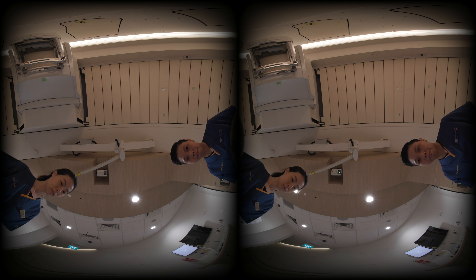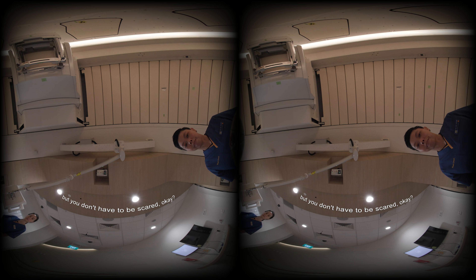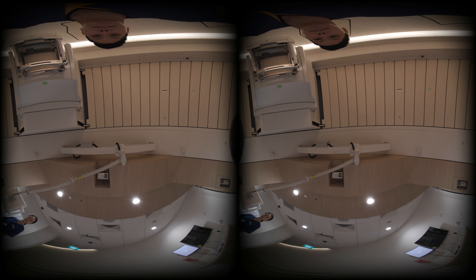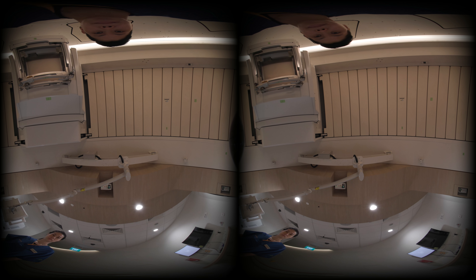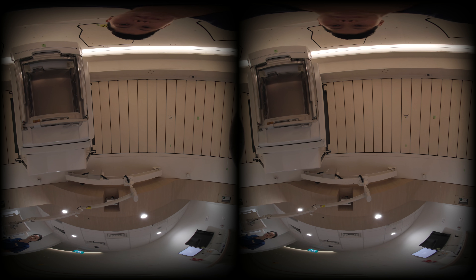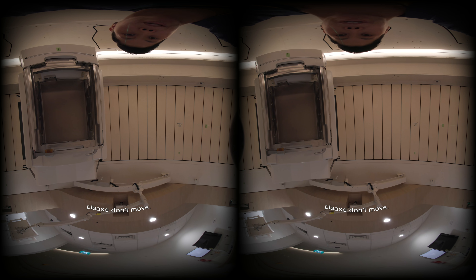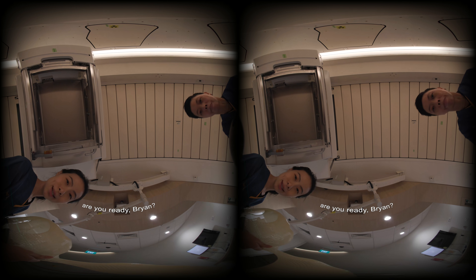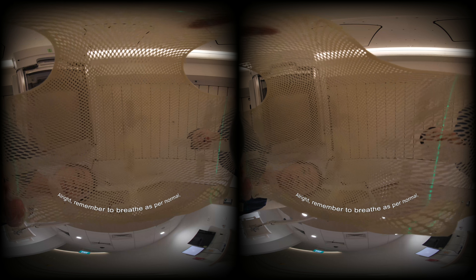Please grab the pole. I'm going to move the bed — you're going to feel the bed moving, but you don't have to be scared. I'll be positioning your head. Please don't move. Are you ready, Brian? We're going to put on a mask for you. Please close your eyes. Good. Remember to breathe as per normal. Breathe in and out.